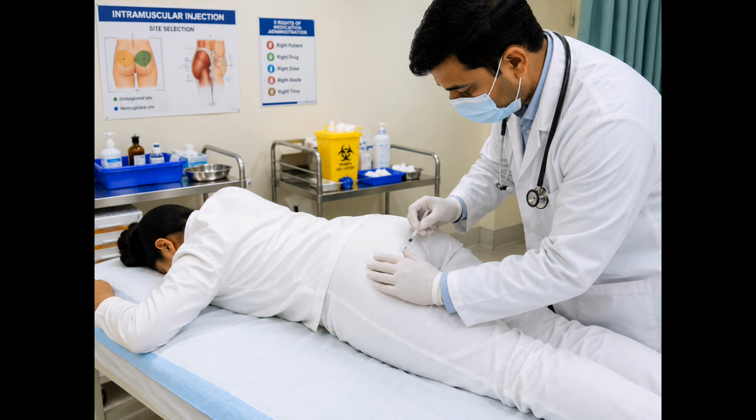How to do an IM injection technique. Buttock gluteal muscle injection step by step. Intramuscular IM injections are commonly used in healthcare to deliver medications directly into muscle tissue, where they can be absorbed efficiently. The gluteal region is one of the areas healthcare professionals may use for certain medications when clinically appropriate. Safe IM injection practice requires proper education, knowledge of anatomy, careful patient assessment, and adherence to evidence-based clinical guidelines.